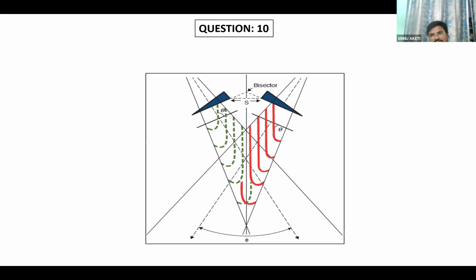You should know or no need to know? Sir, it should be perpendicular. Why did you learn this hinge angle definition? Because when you place two beams with a different angle, what wedge angle combination will give you the better homogeneous distribution inside the tumor?